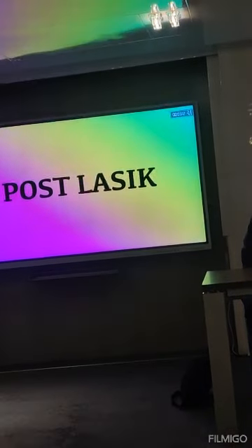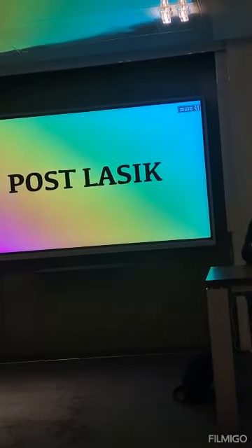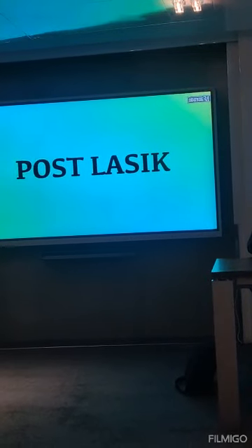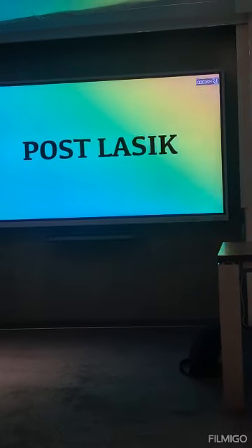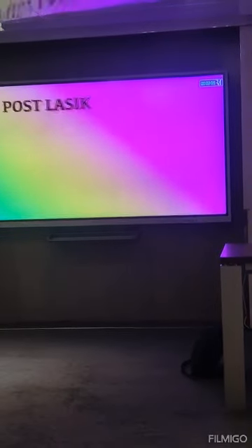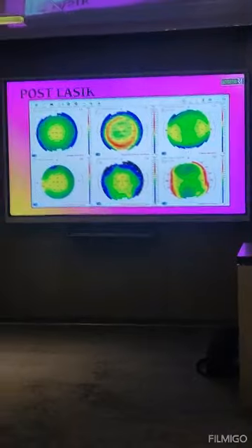Finally, what about post-LASIK? How does it help you in post-LASIK? If you have patients with regression or a residual error after LASIK, you will be suspicious about ectasia or not, and also the cause of the regression.